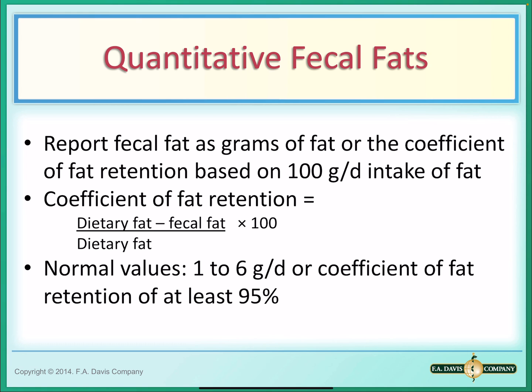Although the Van de Kamer titration is the gold standard for fecal fats, the acid steatocrit is a rapid test to estimate the amount of fat excretion. It is similar to the microhematocrit test, and it is more convenient than the 72-hour stool collection. The acid steatocrit test is a reliable tool to monitor a patient's response to therapy and to screen for steatorrhea in pediatric populations.